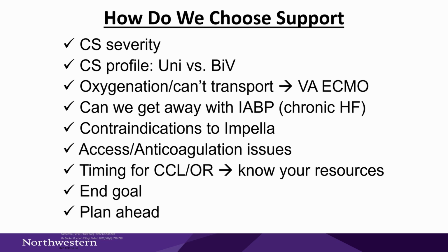This is where an echo can really help. We're thinking about access and anticoagulation issues. We're thinking about timing and resources. You have to know what you can activate, what devices you have, what people you have, and what their comfort level is with different things. I'm very lucky.